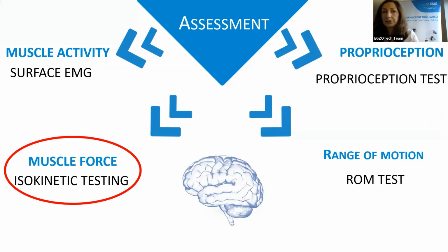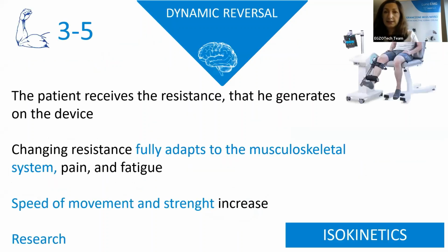Another possibility of the assessment is muscle force. For that purpose we use the isokinetic testing. And we have a program which is called the dynamic reversal. It's one of the orthopedic programs. So here the patient receives the resistance that he generates on the device.